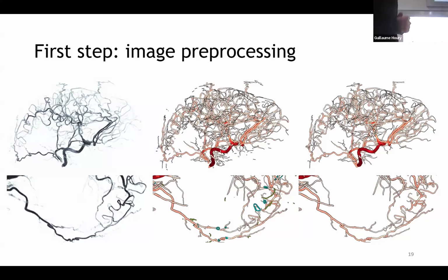And say where the data comes from. So just to be clear, because maybe if you're used to seeing MRI or CT scans, the image on the left seems like it doesn't look like raw data. It already seems to be segmented. But the thing is that when you're working in an interventional context, there are lots of things that you can do that you cannot do usually.